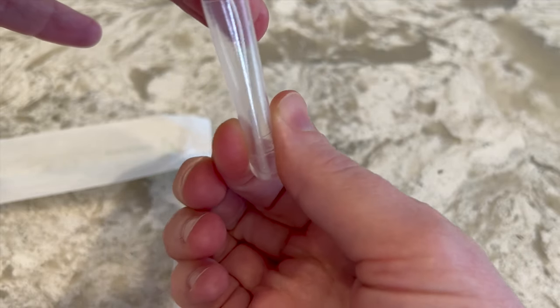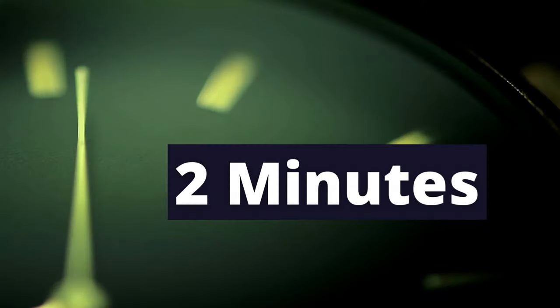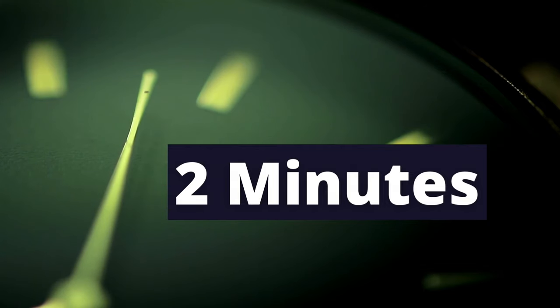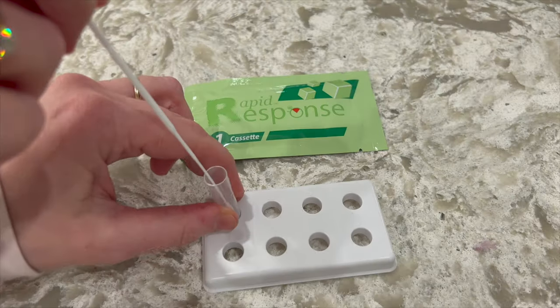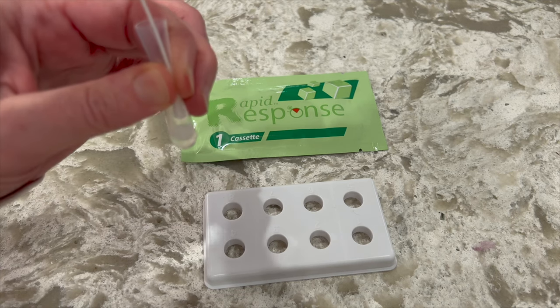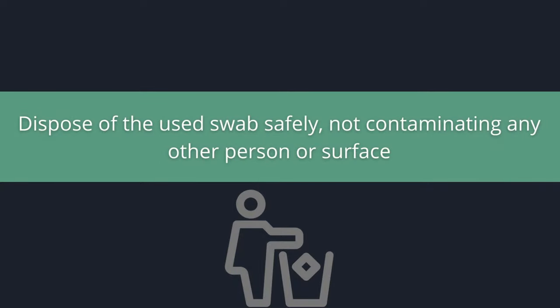With the swab still inside the tube, leave the extraction tube upright in the tube stand. Let the swab stand in the solution for two minutes. After two minutes, remove the swab while pressing the swab head firmly against the inner wall of the tube to release as much liquid as possible. Dispose of the used swab safely so as not to contaminate any other person or surface.